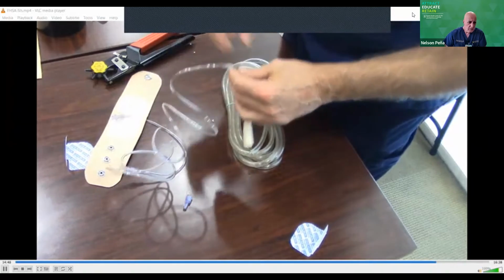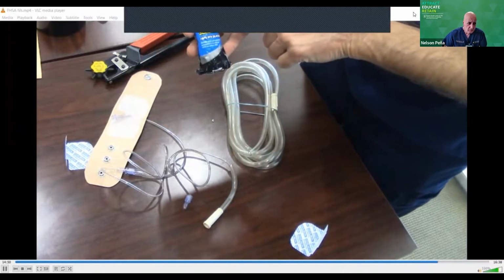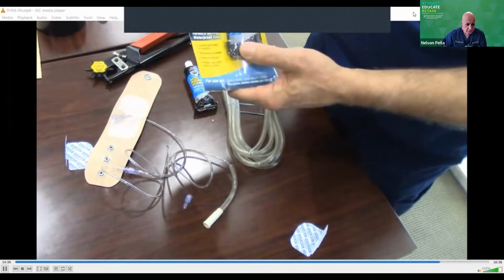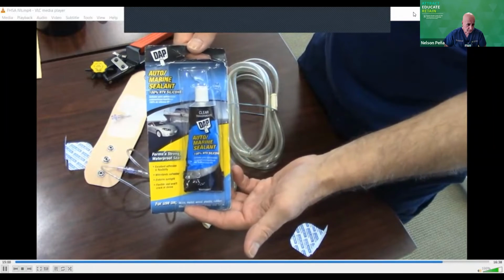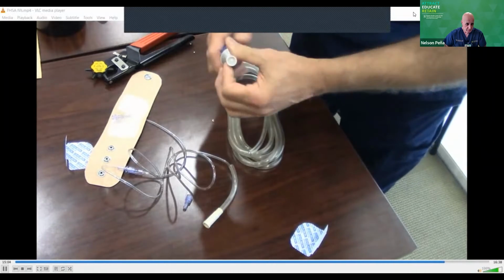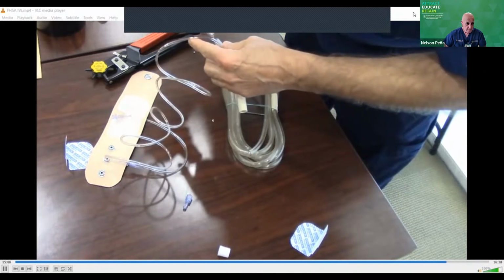And then in here, we are going to put in this auto marine sealant, which you can buy at Home Depot or Amazon or anything like that, and this is what the package looks like. And then we're going to squirt the glue inside of here.